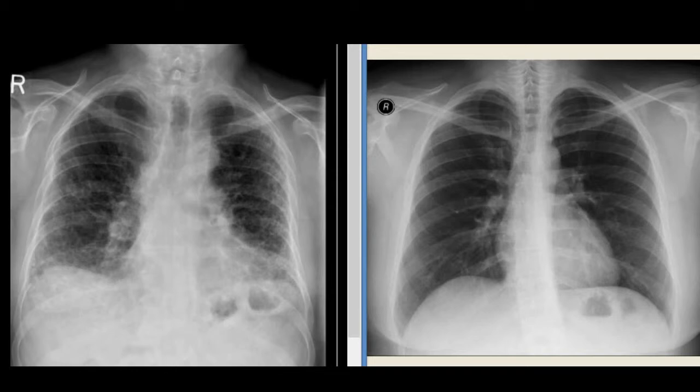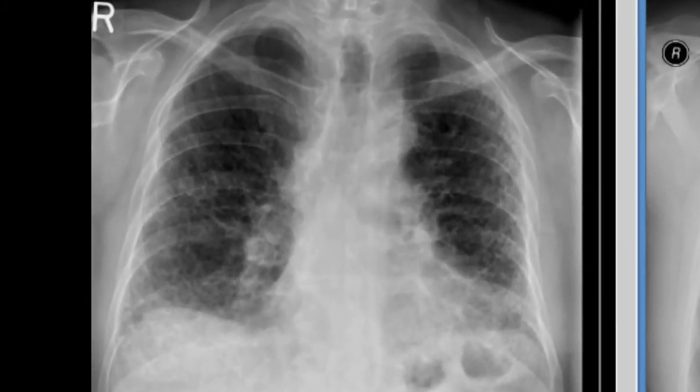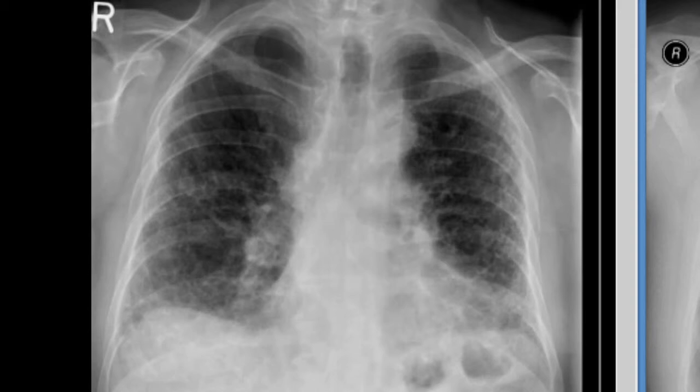Looking at the lung parenchyma, you can confidently say that there are multiple cysts scattered throughout both lungs, commonly known as honeycombing. Also notice the reticular pattern on both sides. The honeycombing is more profound in the lung bases compared to the apices. Honeycombing at the bases, traction bronchiectasis, architectural distortion, and reticular or reticulonodular pattern are all classic signs of lung fibrosis.